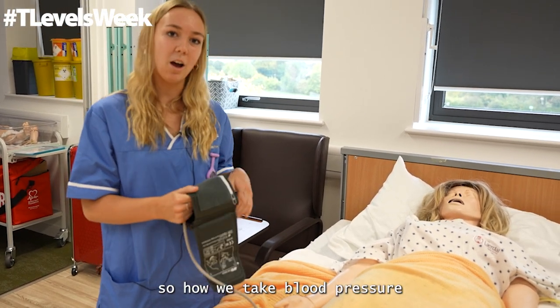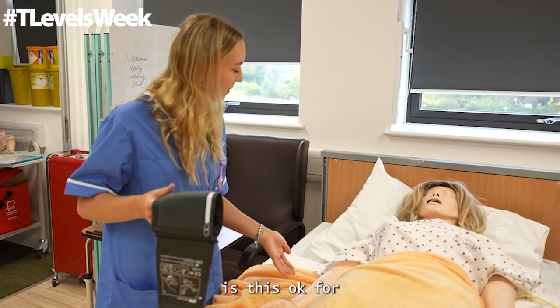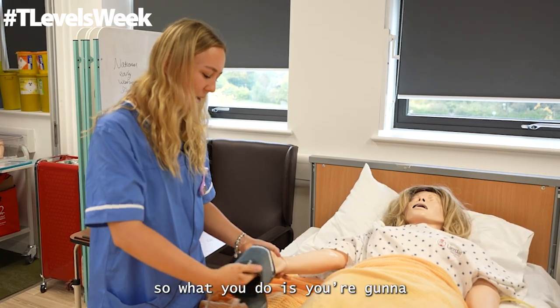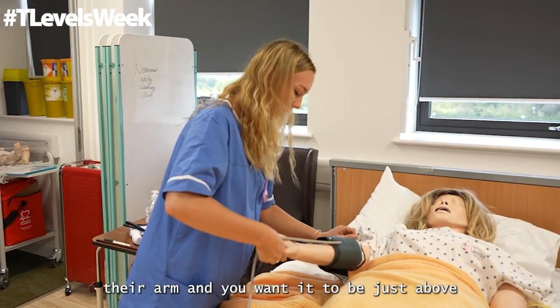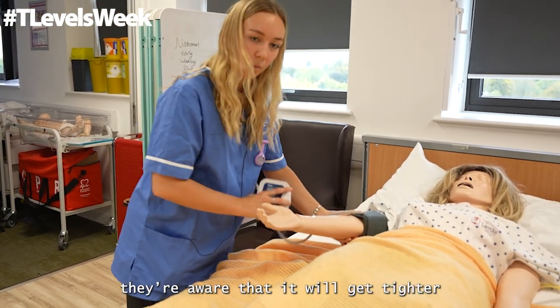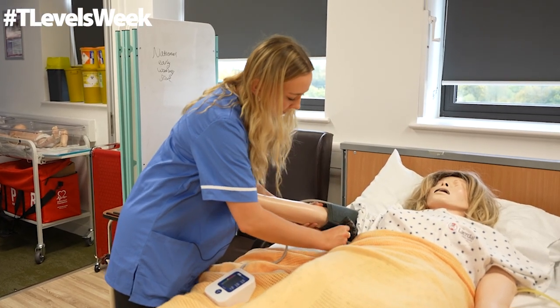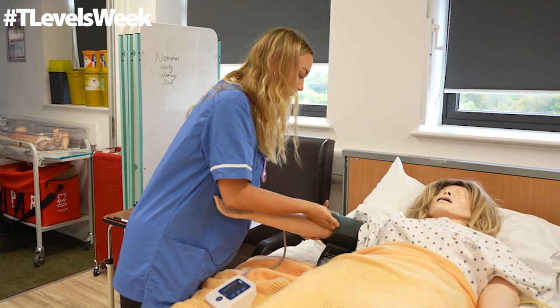So how we take blood pressure, with all observations you must take consent first. So is this okay for me to do your blood pressure, Susan? So what you do is you're going to put the blood pressure just across their arm and you want it to be just above their elbow. And it will be tight, so you want to make sure they're aware that it will get tighter and it might be uncomfortable and that they can stop if they want. You want to tighten it enough so you have 2 finger spaces just below.